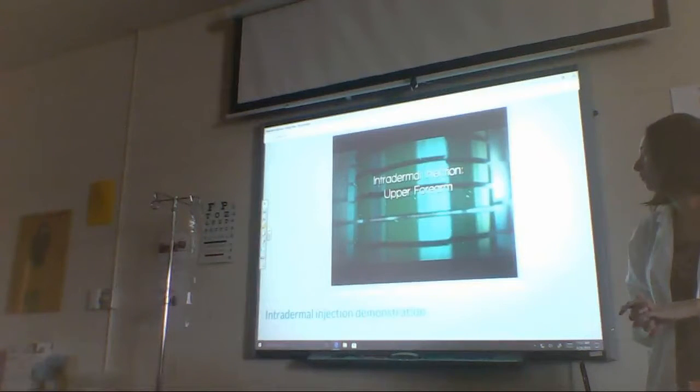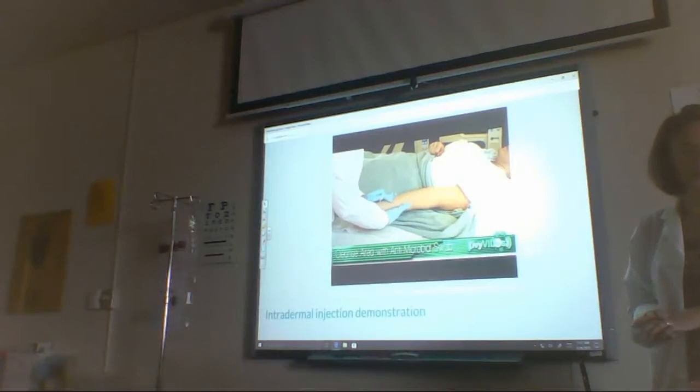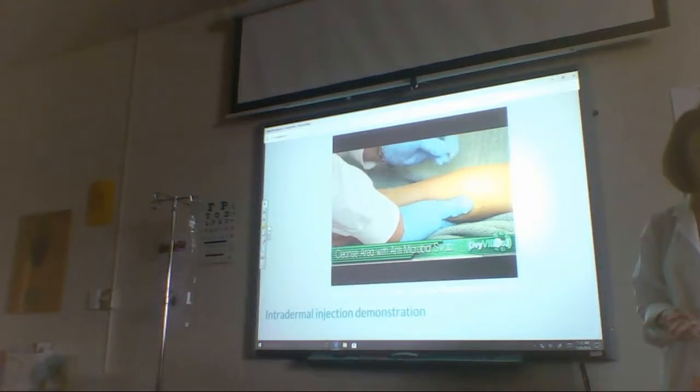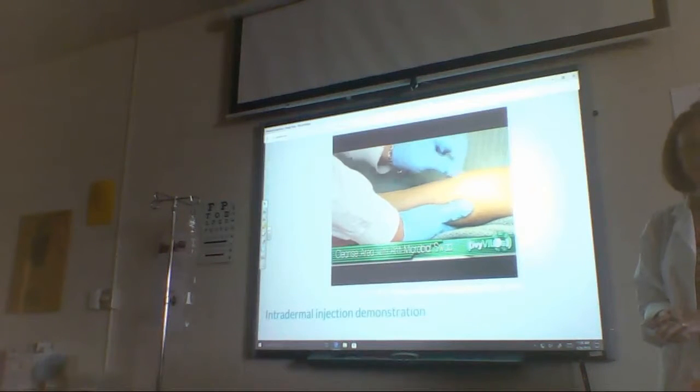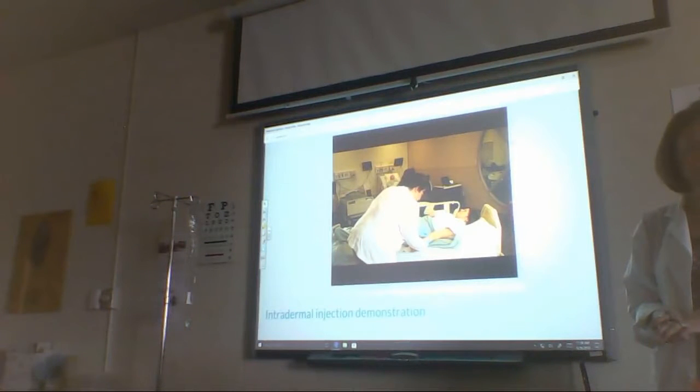Intradermal injection. Cleanse the area with an antimicrobial swab. Use a firm circular action moving outward from the center. Let the area dry.